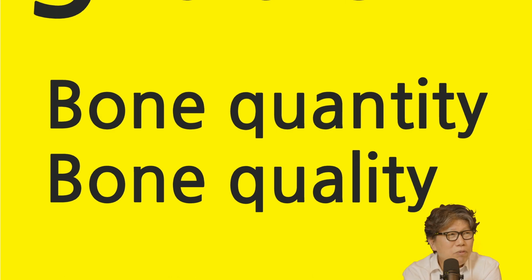But most of the time, it's non-functional bone, and in my case, it had a cement-like feel to it, so when I put function on it, the graft bone just dissolved. So a lot of people write GBR books and talk about different things, but the outcome is not good.